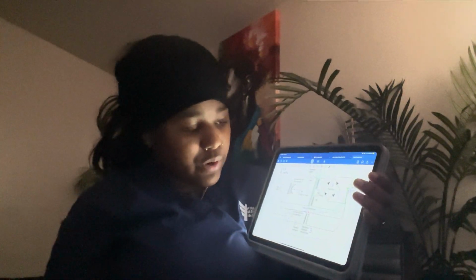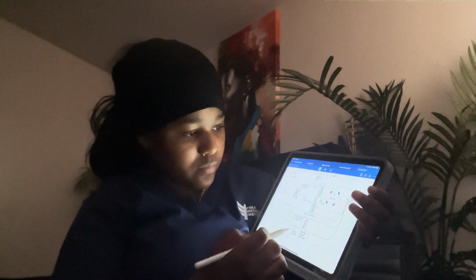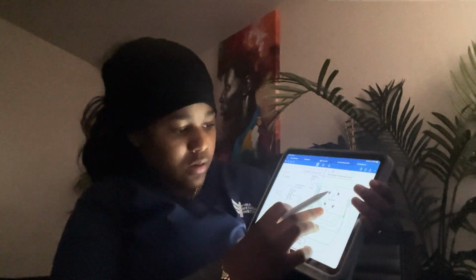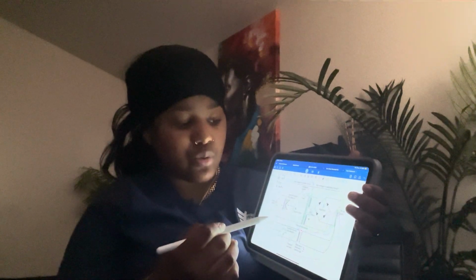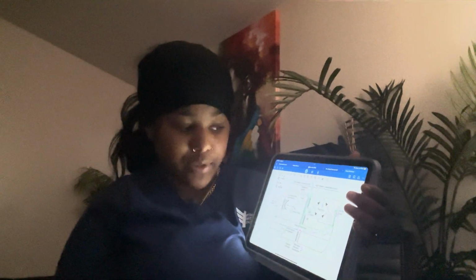Furthermore from there, we also have the cathode and the anode filament. The cathode filament is basically what's going to allow us to produce imaging again.